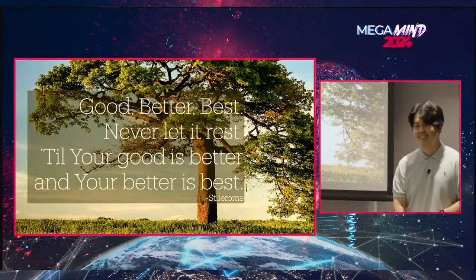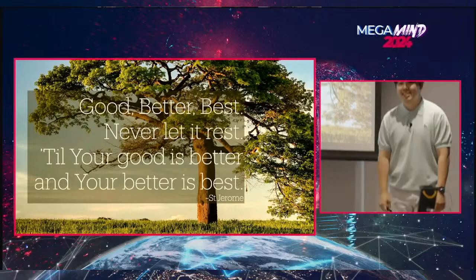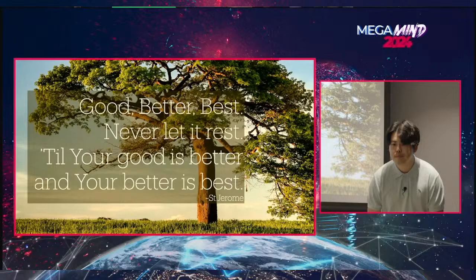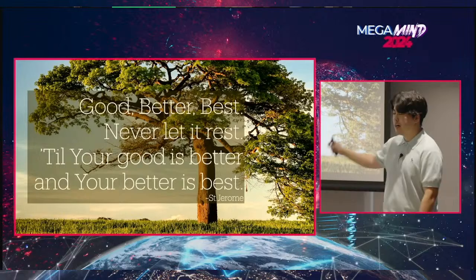That's a nice presentation. I'd like to ask, did you do any gap grafting for this case? Yes, graft. The small gap around the implant was filled with allograft. So you prefer allograft more than xenograft, is that right? That's right. So what do you think about other kinds of materials, such as calcium phosphate or something?